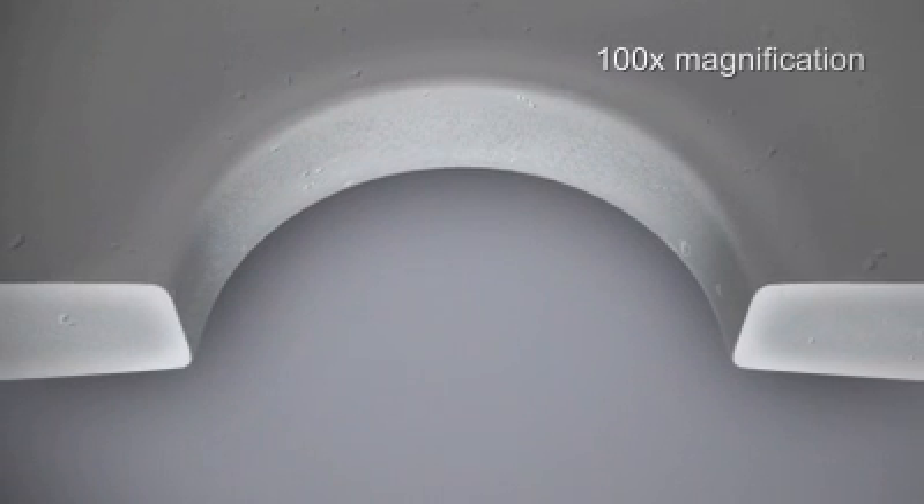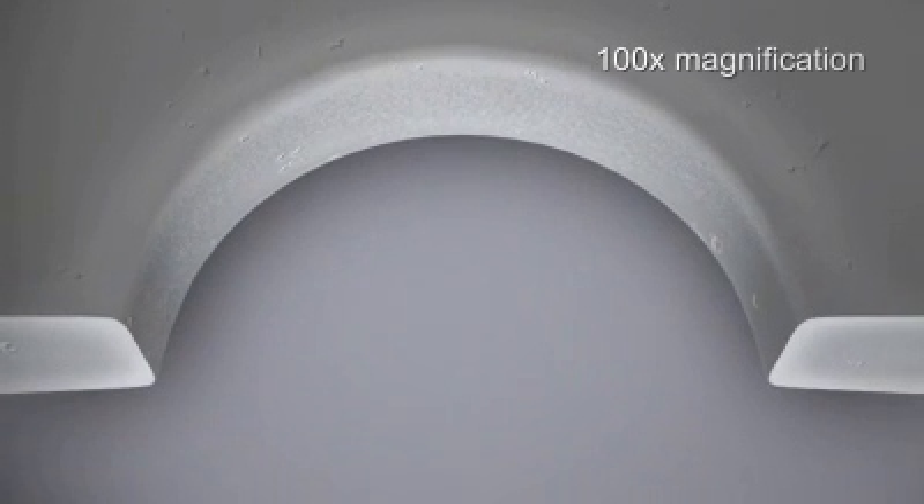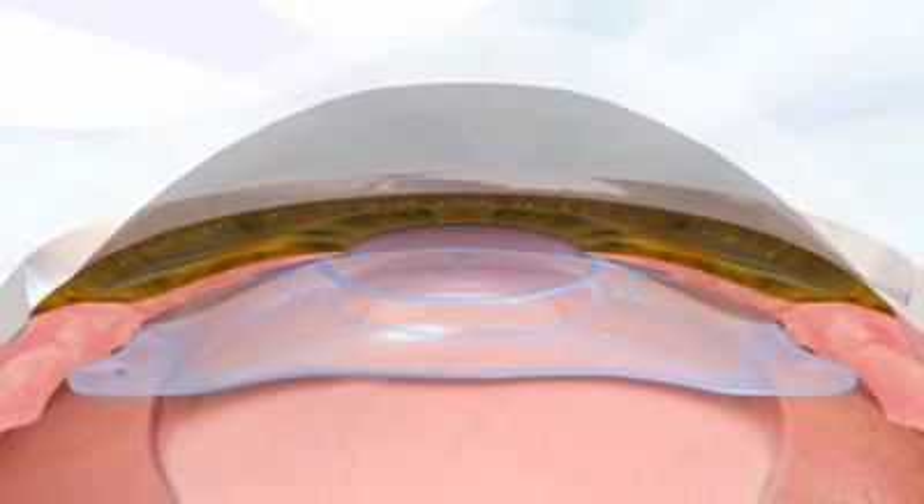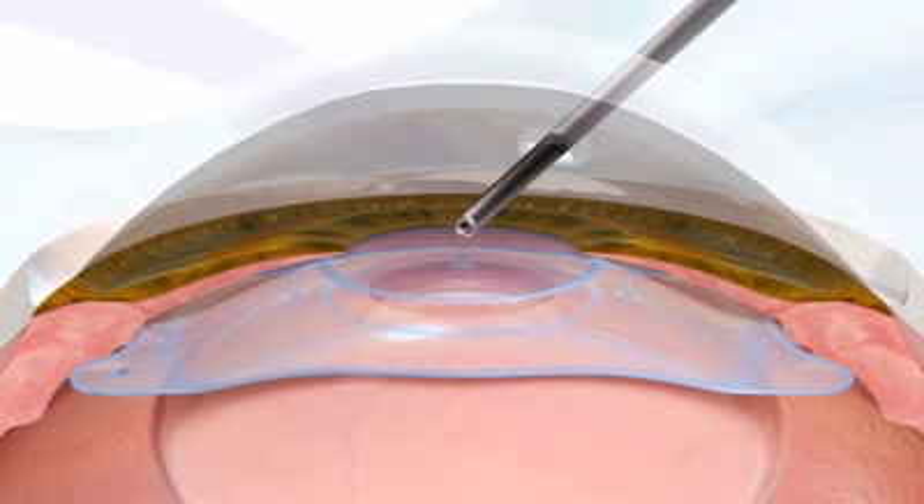The combination of an optimized port size and the port's smooth, rounded edges, enhanced by the nature of the collameric material, allows the Visian ICL V4C to retain excellent vision quality. As an added benefit, irrigating through the KS Aqua port to flush viscoelastic into the anterior chamber may facilitate viscoelastic removal.